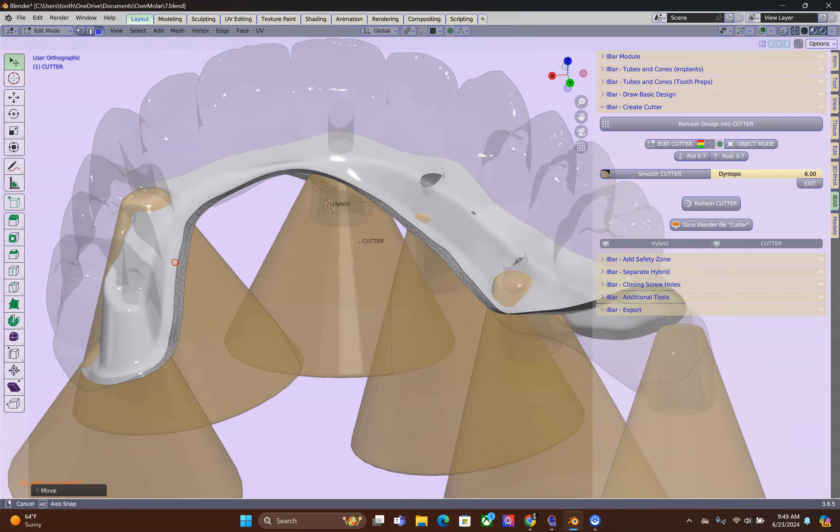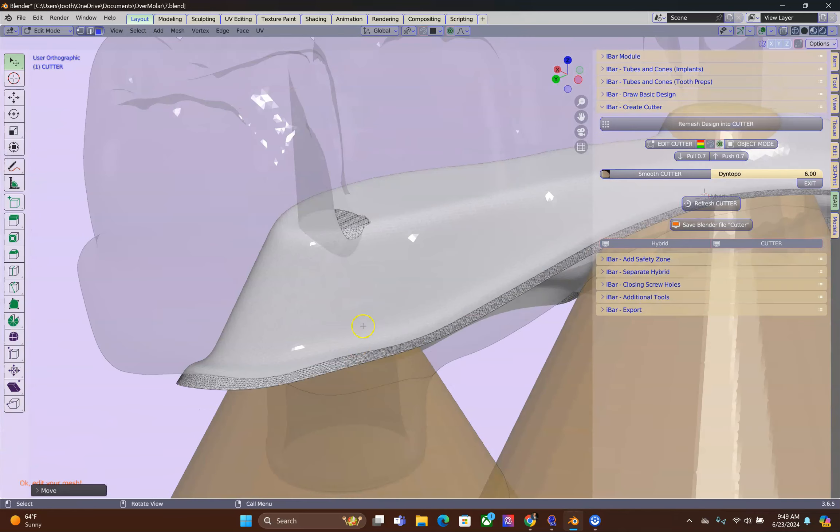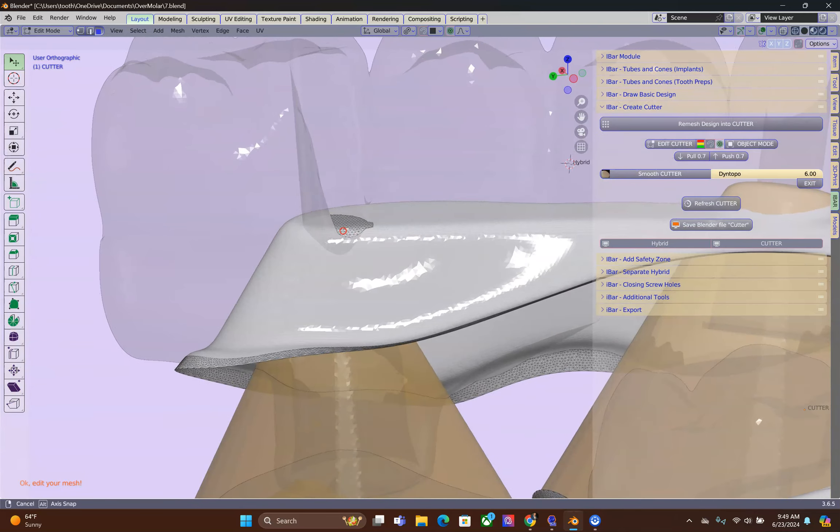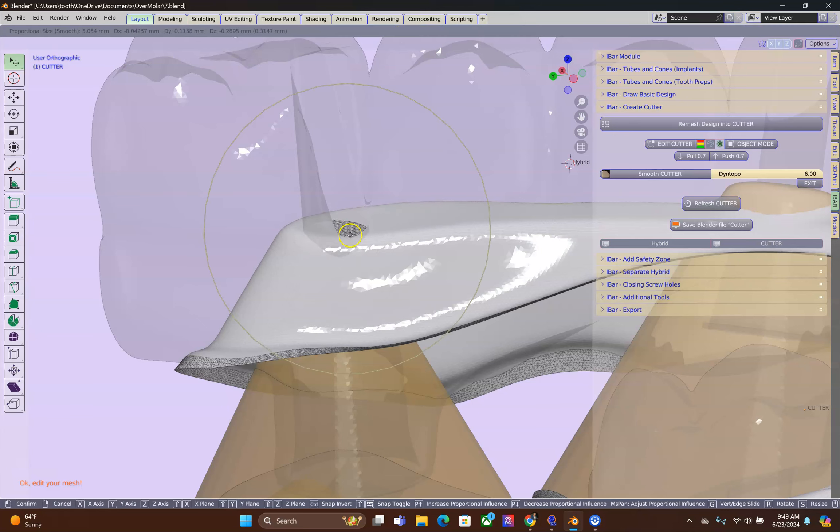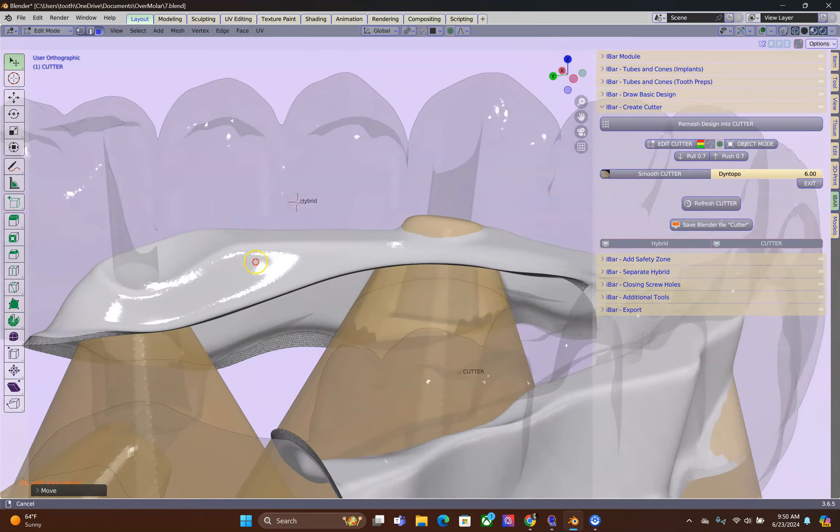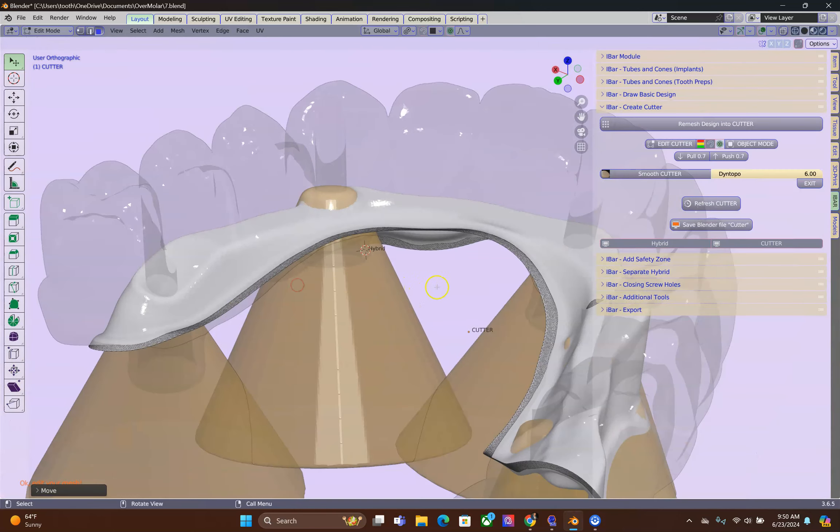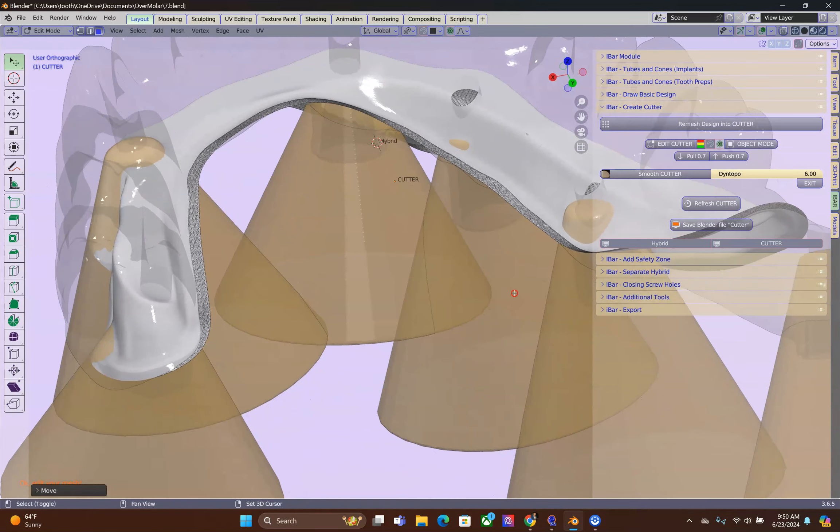Alright, we're going to go to the other side and we're going to do the same thing. It is important to rotate the scene, sort of, so that it's parallel to your screen. Then you can grab the vertices in the correct direction.